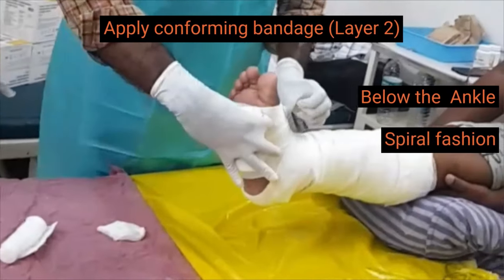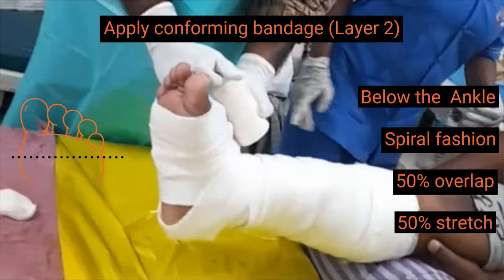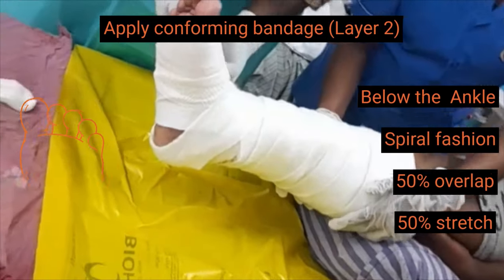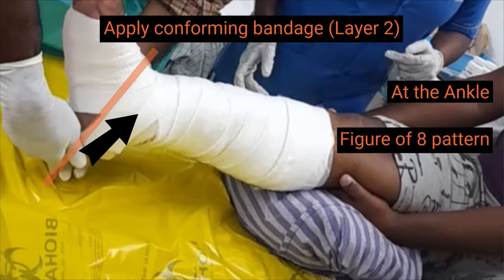The second layer is wrapped loosely in a spiral fashion with 50% overlap from the base of the toes to the ankle. At the ankle level, the bandage is wrapped in a figure of 8 pattern.